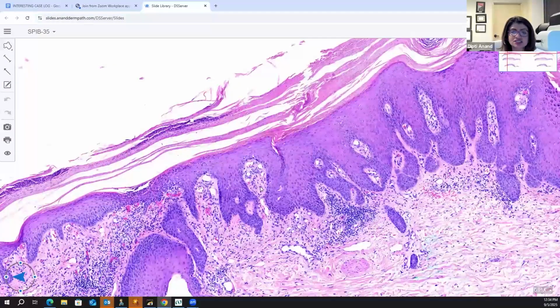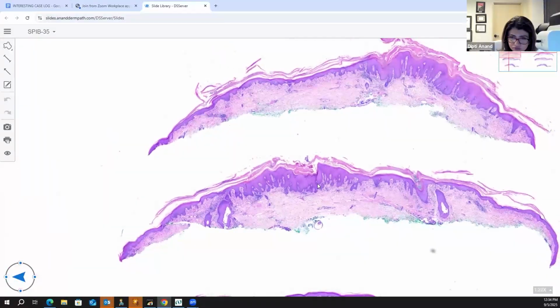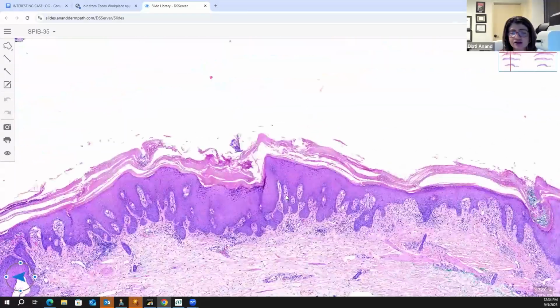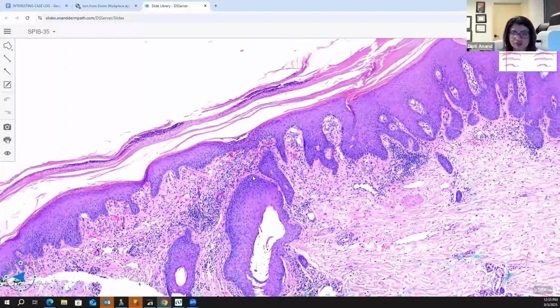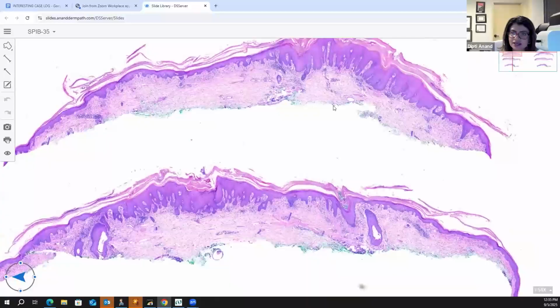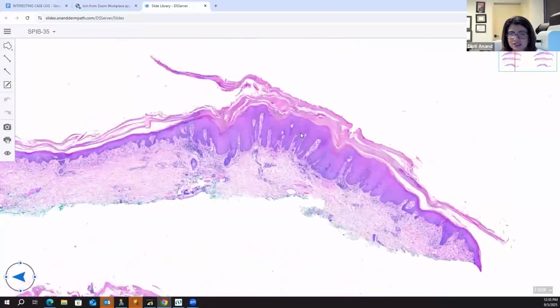Wonderful job. So this is a very common biopsy where, clinically, often this patient probably has psoriasis and he had this lesion where they thought it was like a squamous cell or something. It's not uncommon. And this is what is also referred to sometimes as verruciform psoriasis. And you can see that the areas in there are markedly thick. This area even has a prominent granular cell layer.